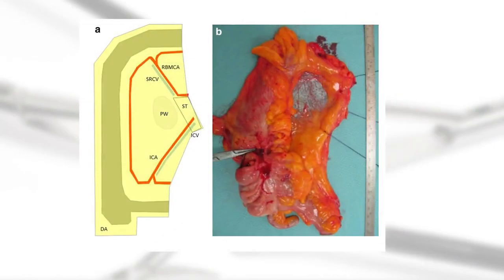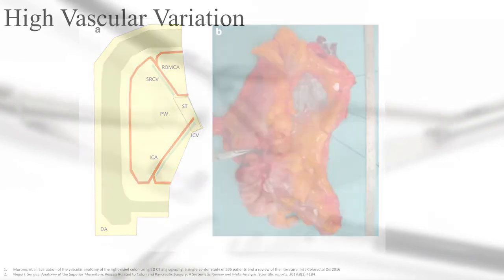The optimal CME specimen has no fascial defects. The stocks of the ileocolic vessels and middle colic vessels are connected by tissue of the surgical trunk, which represents the lymphatic tissue package covering the superior mesenteric vein. Finally, the mesocolic window, or sail as it is also called, has a complete medial flap of mesocolic tissue as shown in the picture.